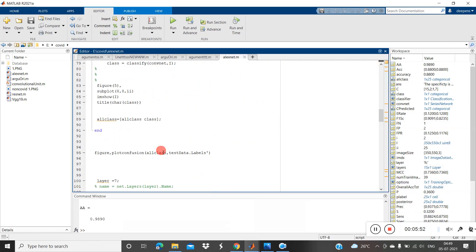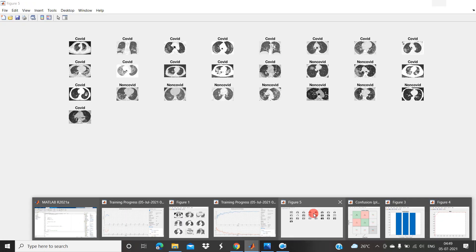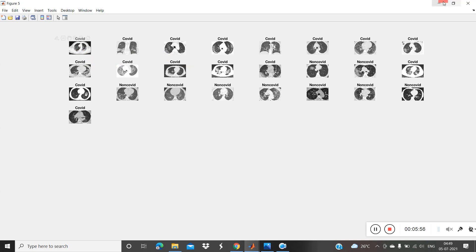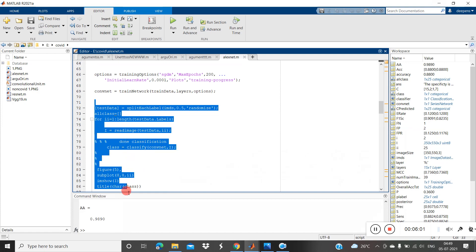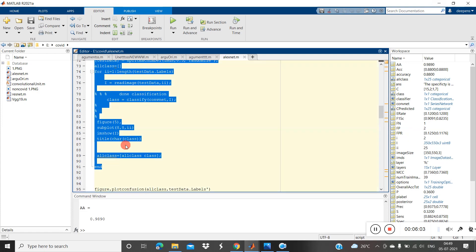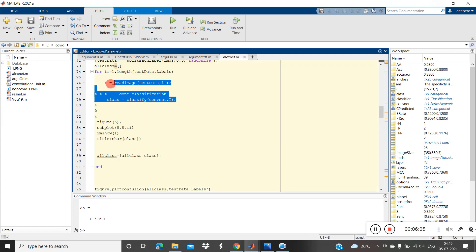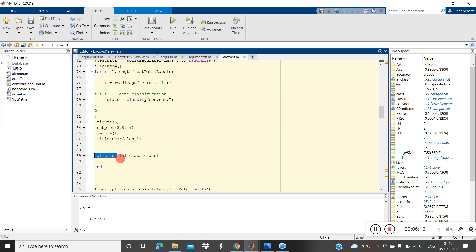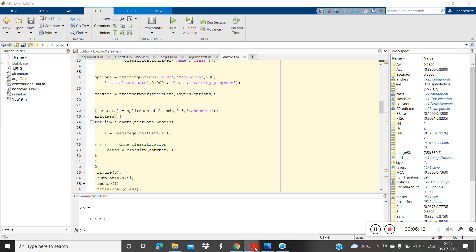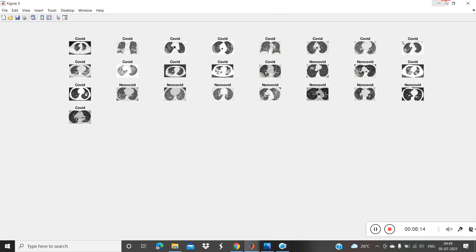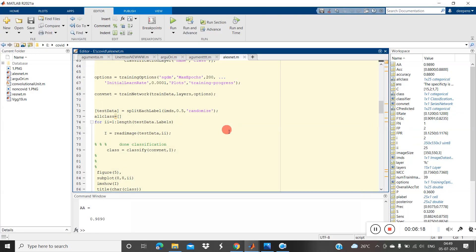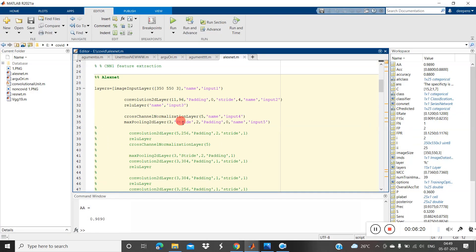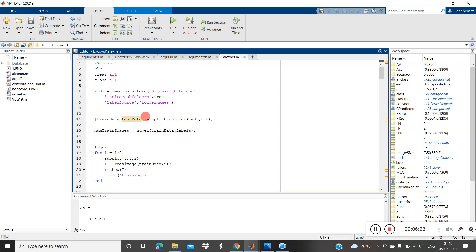This result is based on AlexNet. The reason all the images are appearing is because we split the training and testing data — I took testing images separately, read them one by one, classified each one, and saved the result for each class. That's why all images are coming from the test samples. So now we have the result based on AlexNet.